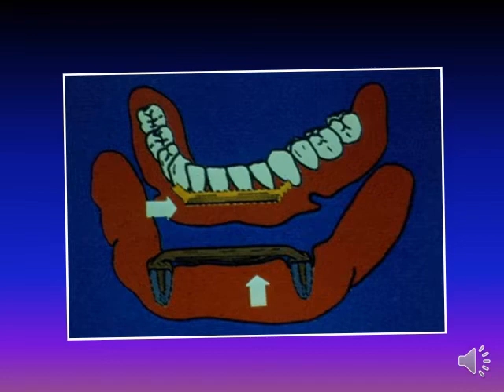Fixation is achieved by a female housing that is either embedded in the acrylic of an overdenture, or soldered to the substructure in the overdenture. The female housing can be rigidly attached to the male and classified as a non-resilient attachment, not permitting movement. It could also be designed with a spring load or some other engineered style to provide controlled movement and therefore classified as a resilient attachment.